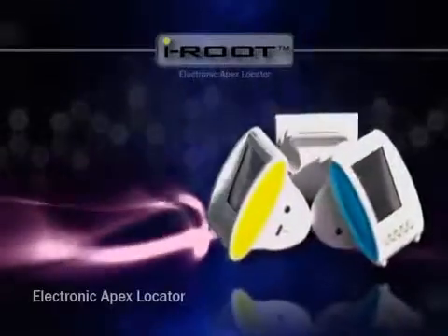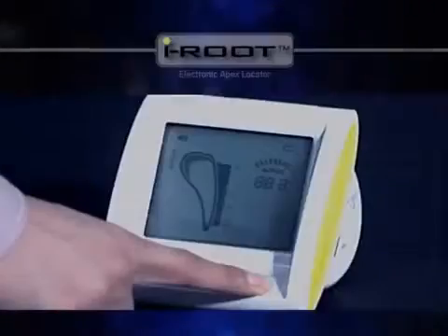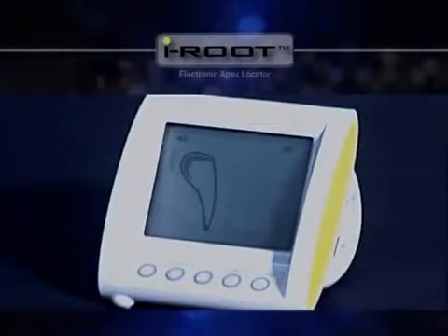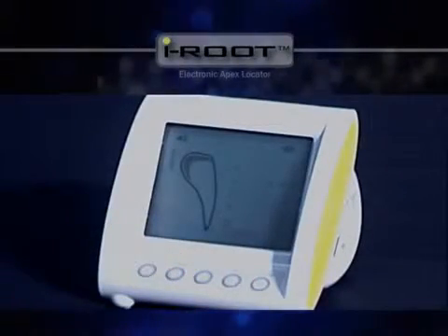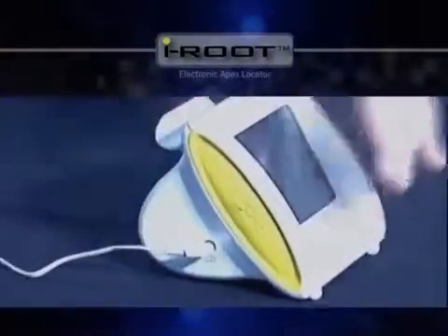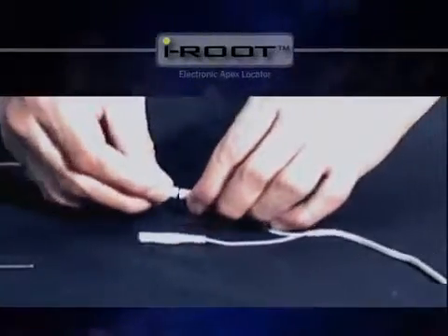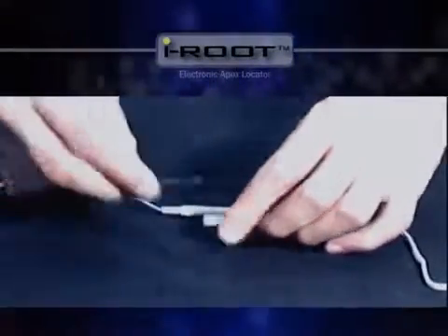Now we'll see what you need to prepare before using iRoot. First, check if the LCD screen works fine when the unit is on. Then connect the probe cord and connect a lip clip and a file holder to the two ports of the probe cord.